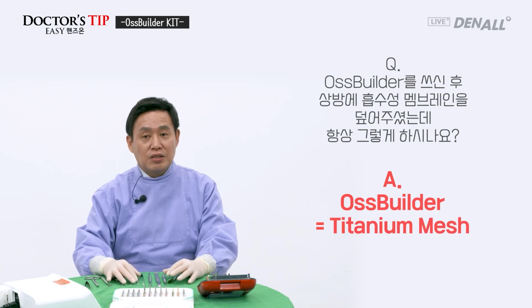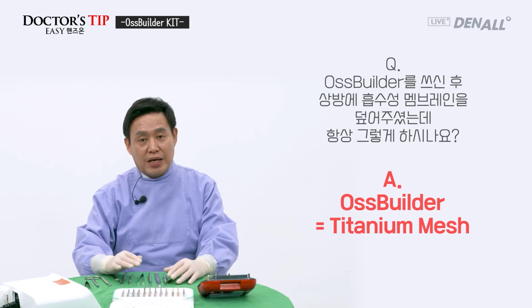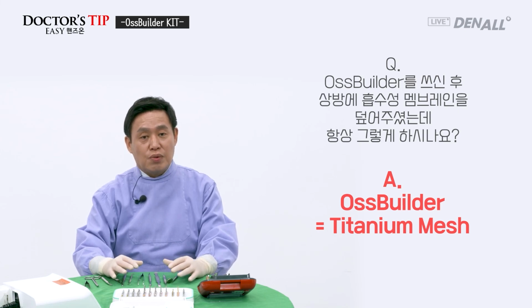The OssBuilder is titanium mesh. So in terms of GBR, it does not prevent soft tissue from growing in. After we do OssBuilder, after 6 months, and as we do second surgery, you see that soft tissue covers the entire OssBuilder. Therefore, OssBuilder is good for space maintenance in terms of GBR, but we cannot prevent soft tissue from going in on top.